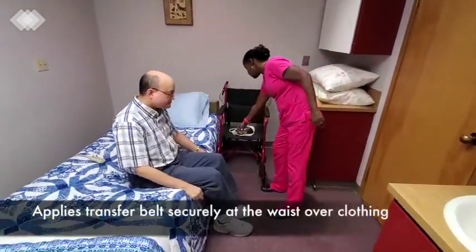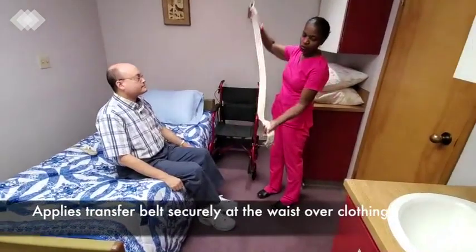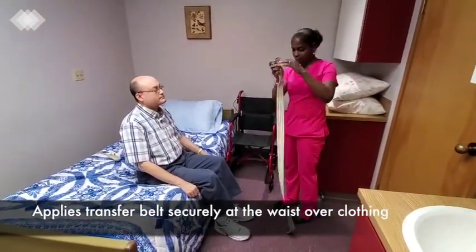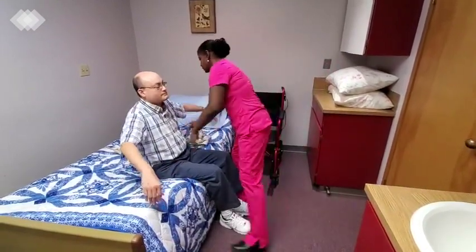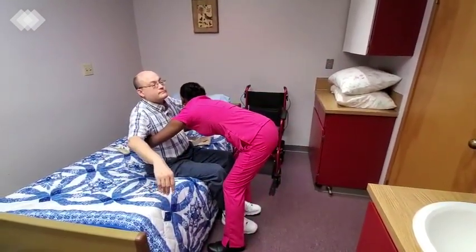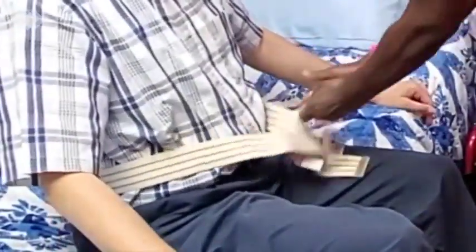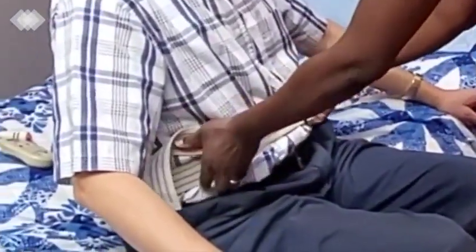I am going to use the gait belt with the inside against your skin. Can you lift up your arms, please? I will have it come around you, come through the teeth of the gait belt, and then pull it to tighten it. Then I will secure it on the other side, so I can see that it's nice and snug.